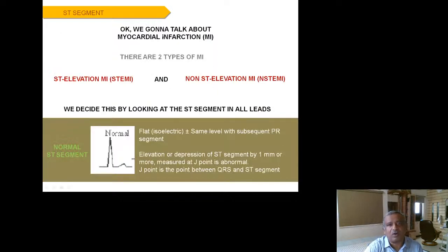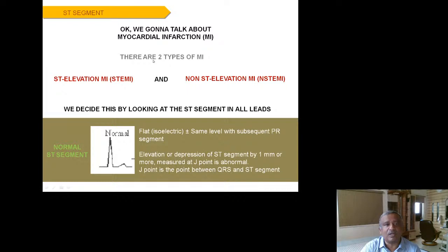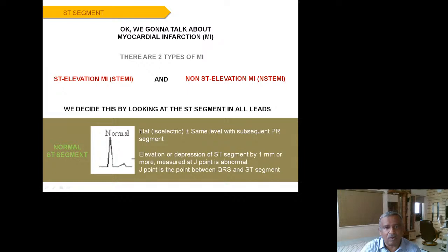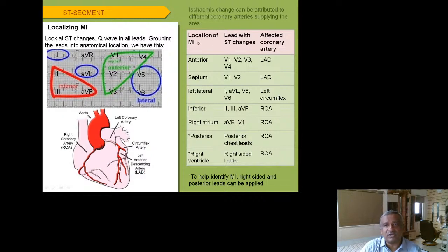The most common indication for ECG is diagnosis of cardiac ischemia. There are two types of MI: ST-elevation MI (STEMI), previously called Q-wave MI, and non-ST-elevation MI (NSTEMI), previously called non-Q-wave MI. We distinguish these by looking at the ST segments across all leads. ST elevation or depression of 1 mm or more measured at the J-point (the junction between QRS and ST segment) is abnormal.